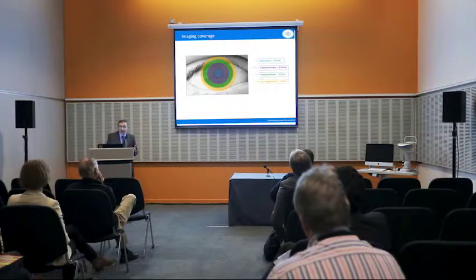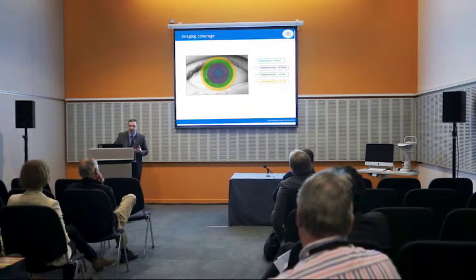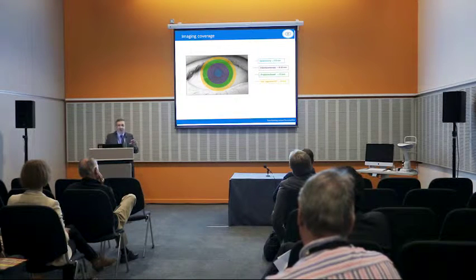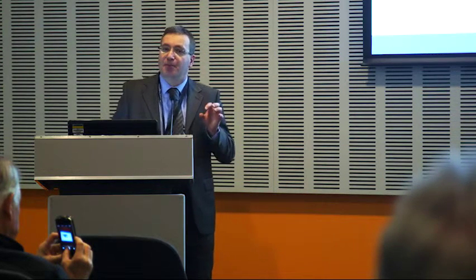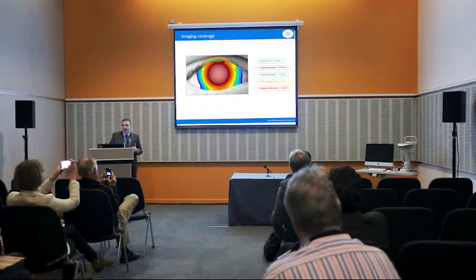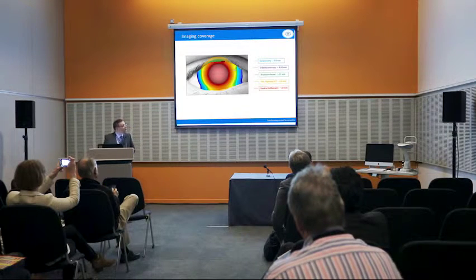Keratometry, we're looking at a central 2 to 3 millimeters. Video keratoscopy with a standard Placido-Disc-based device or an LED reflection-based device, we're looking at something like 8 to 10 millimeters coverage. Projection-based systems like Pentacam and Scheimpflug type imaging, which I didn't mention, you can get up to about 12 millimeters. But beyond that, the reflectance of the sclera actually limits any useful measurement of the sclera whatsoever. We have anterior segment OCT, which gives us up to about 15, 16 millimeters, but costly. But with profilometry, the ESP, we're able, as we said, to measure up to 20 millimeters.